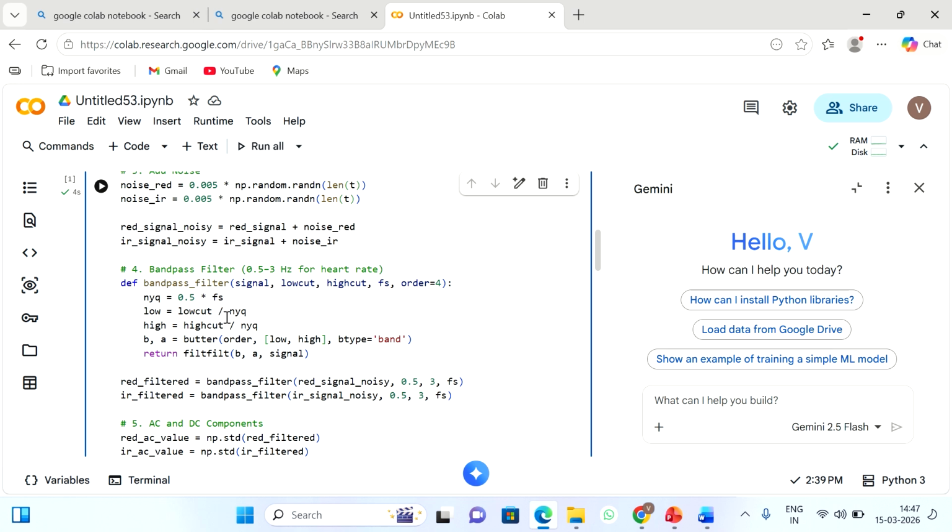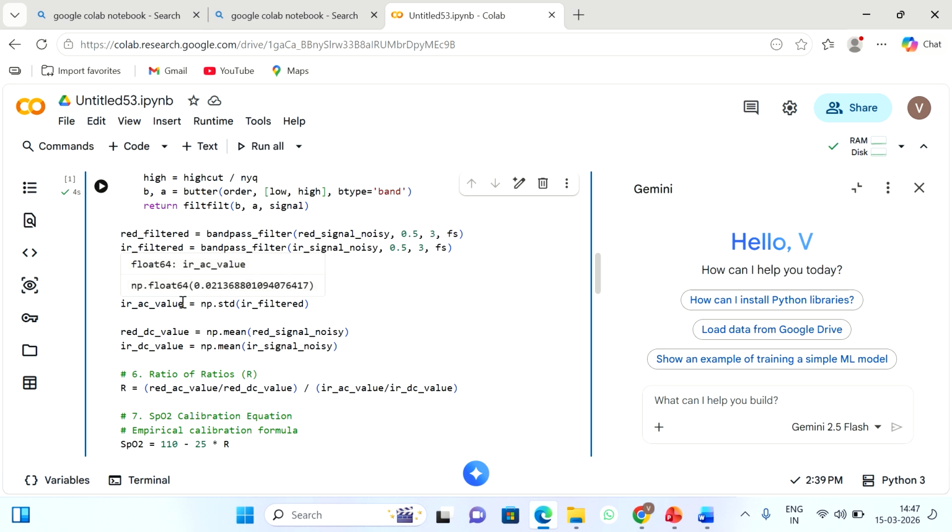Next one, AC component. AC and DC component. red_AC_value is equal to np.std of red_filtered. So IR_AC_value is equal to np.std of IR_filtered. So the standard deviation is equal to the pulsatile amplitude. It represents the AC part. DC means it is a straight line. There will not be any peak.